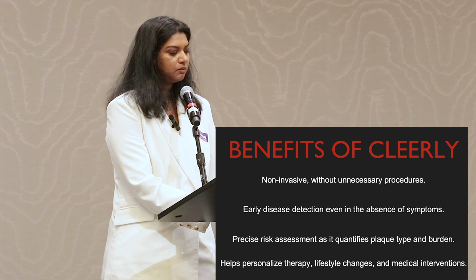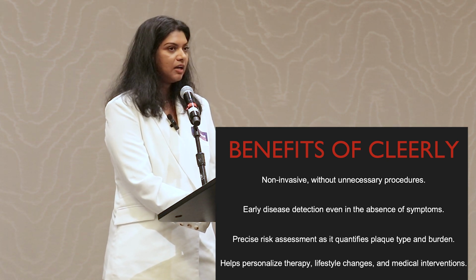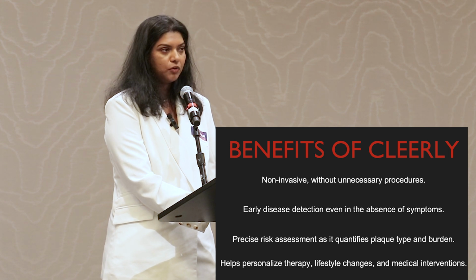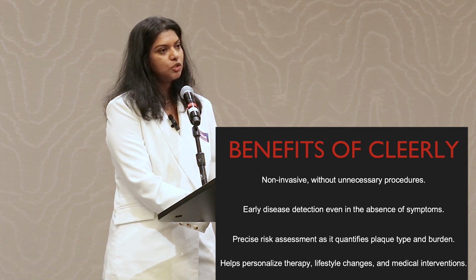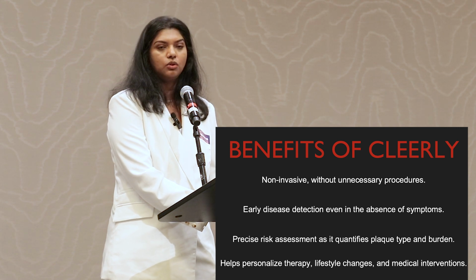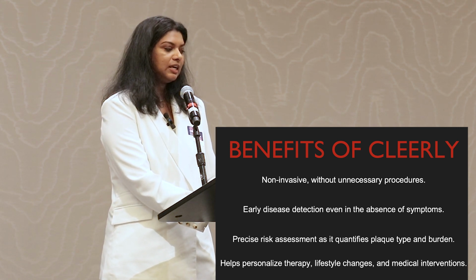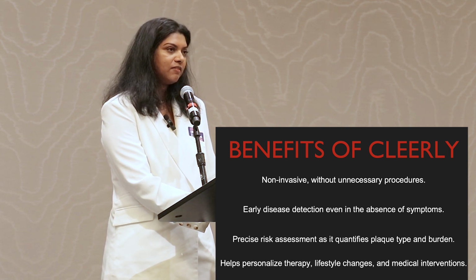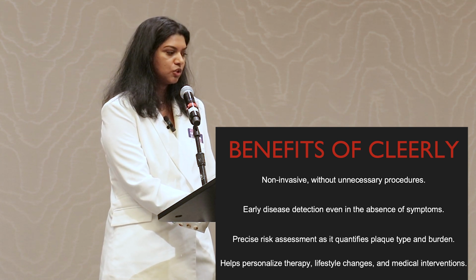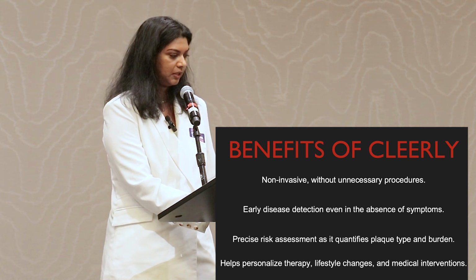It also helps you in the patients who you might consider high risk, maybe they have a high LDL, but they absolutely have no plaque. Well, now they have a choice. Do you want to be on medicine, or do you want to try everything you can through diet and lifestyle changes to determine this risk? So you're really driving down that personalization of therapy, evidence-based personalization, individual care based on the patient's actual plaque burden, disease burden.